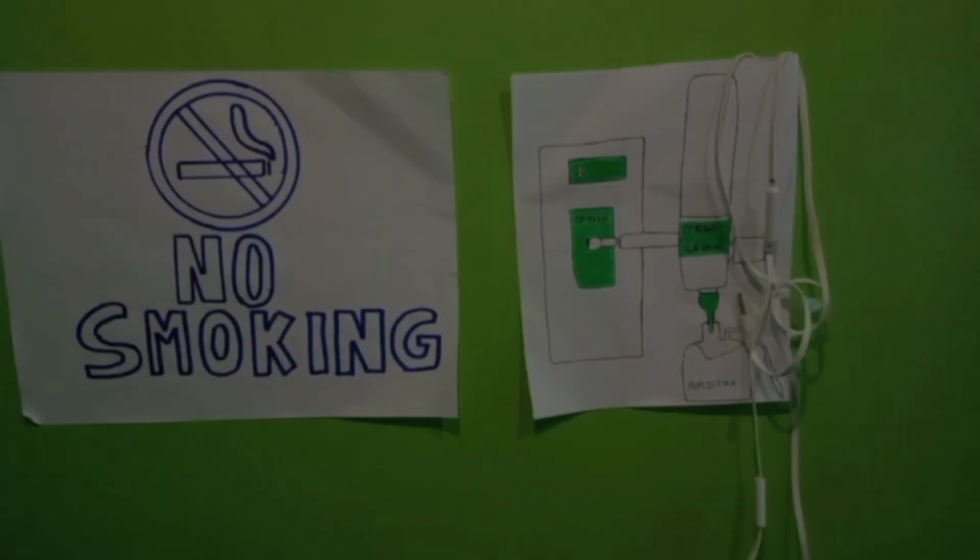And lastly, assess for clinical signs and symptoms of hypoxia, like anxiety, decreased level of consciousness, inability to concentrate, fatigue, dizziness, cardiac dysrhythmias, and dyspnea.